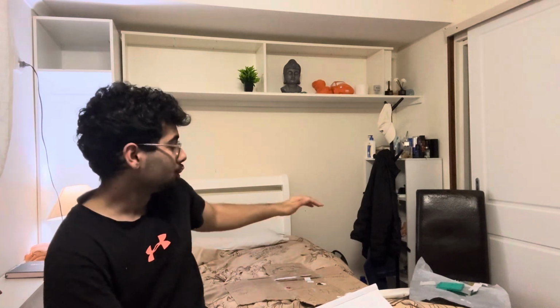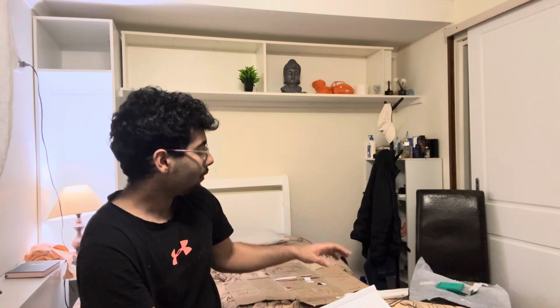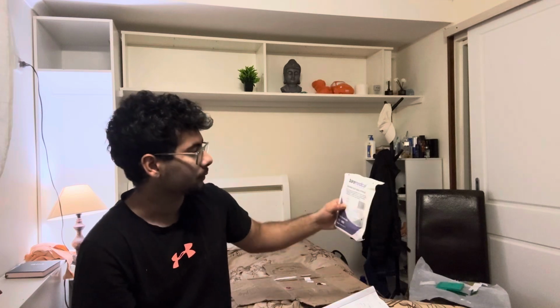So I'm going through the step by step procedure of what exactly you have to do. Once everything's done, do hand hygiene, take this trolley out, and clean the trolley with an alcohol swab so that there isn't any infection or sign of contamination. Once that's done, you take out all the stuff that you need, so you are not running back and forth. What stuff do you need? You need a suture cutter to cut the suture. You need the one that I said, this one, the wound pack.